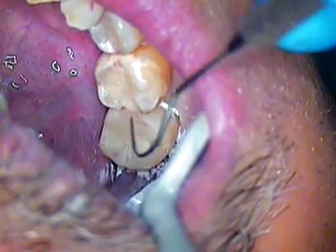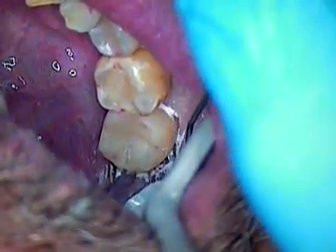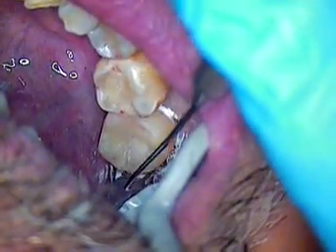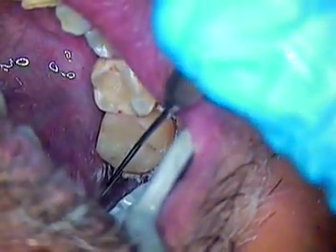It is seated all the way — it has full coverage, complete coverage of the tooth. With cuspal coverage, we're protecting the tooth from any damage.